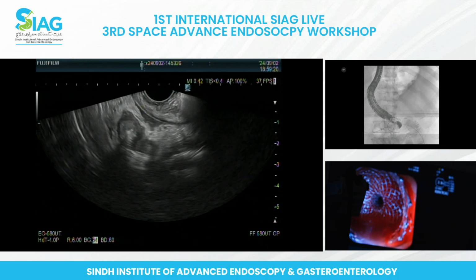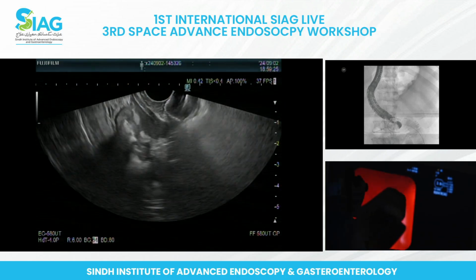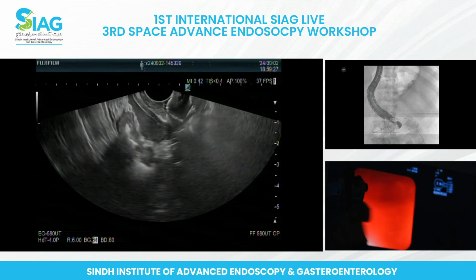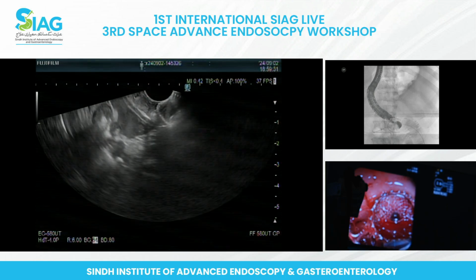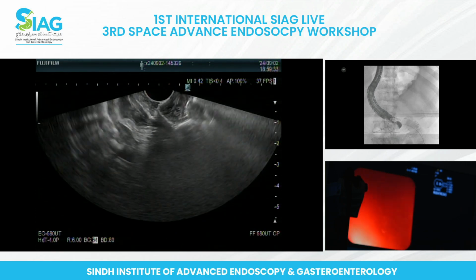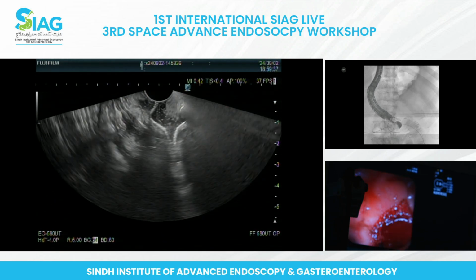Okay, excellent, that's fine. Thank you, yeah, we see that. Okay, good. So what you like to see is, now if you put in dye, you will see the blue thing coming out.